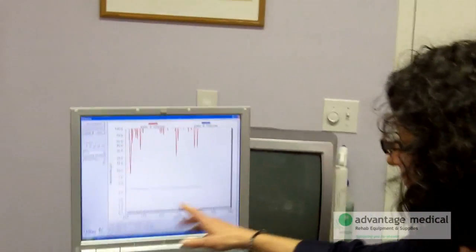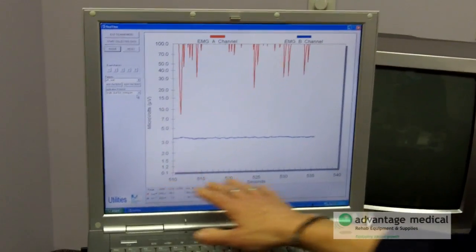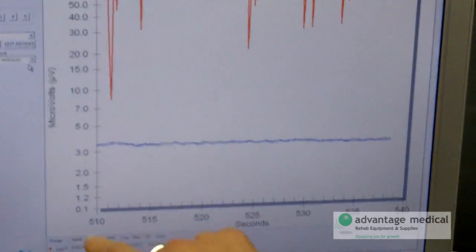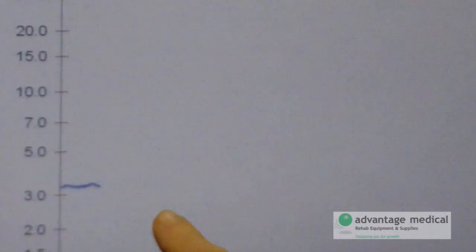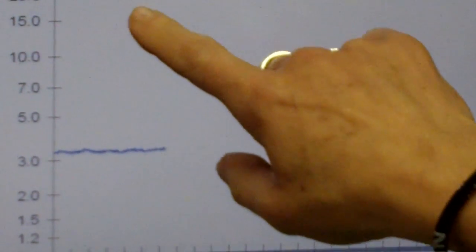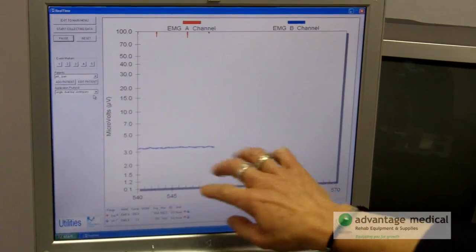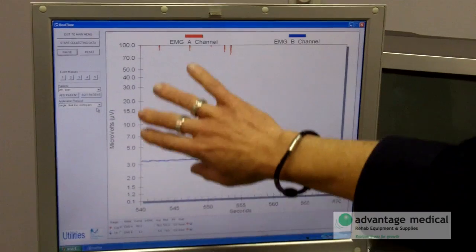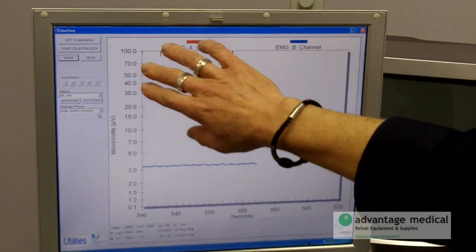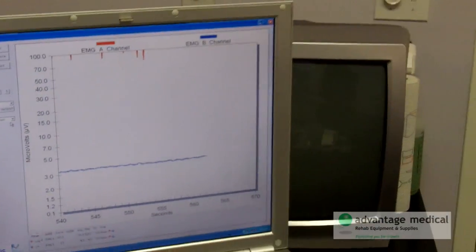And you can see at the bottom of the screen — just like any graph — you have numbers at the bottom, and every five seconds is a number. We're looking for a bell curve here. As it goes up, you want to hold it up there for the five seconds, and then release for five seconds. If you're having difficulty with the release, feel free to release for longer. This is in microvolts — that's your power — and this is your time. So we're going to do that until it gets to 300.